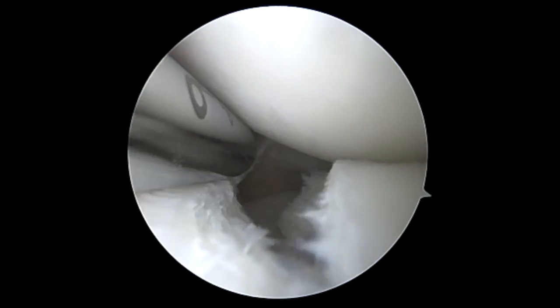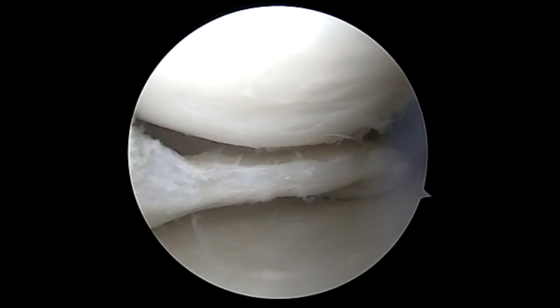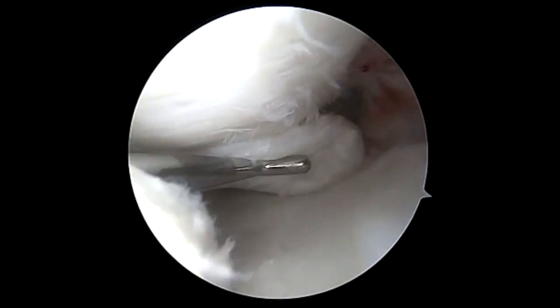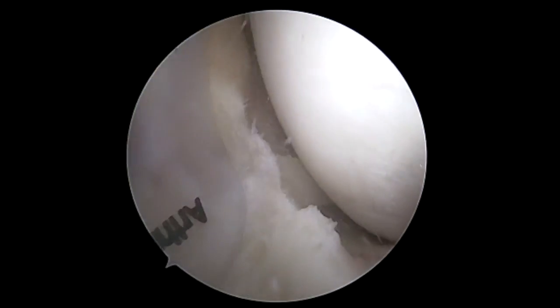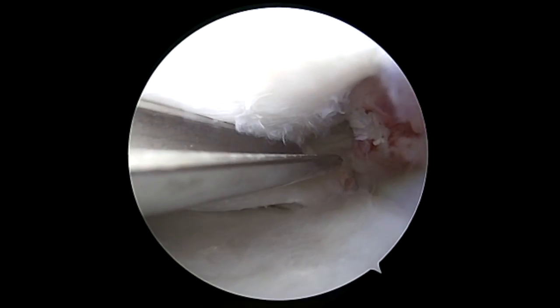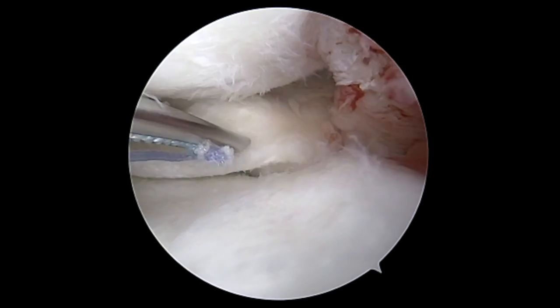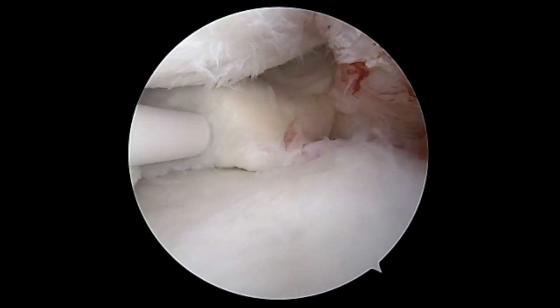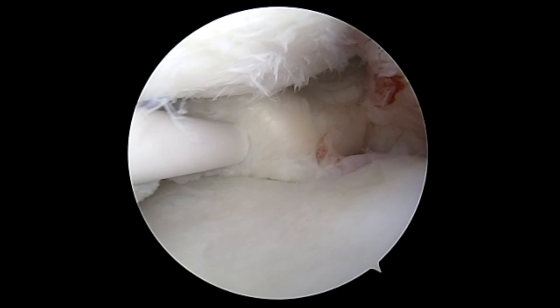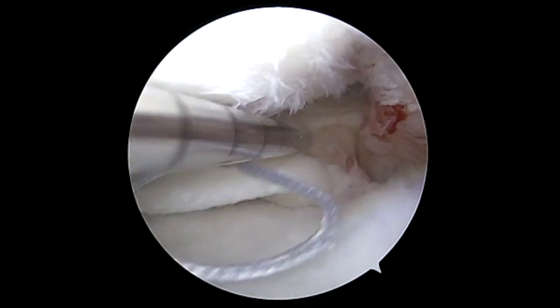We are cleaning the tear pattern and making sure we've got adequate debridement for the repair. You can see that the tear is reducible, and we place a cannula to prevent any catching of the sutures or a suture bridge. Here we're doing an Arthrex FiberStitch into the root area to reduce the meniscus back. This will give us our initial fixation and prevent the meniscus from continuing to bucket.